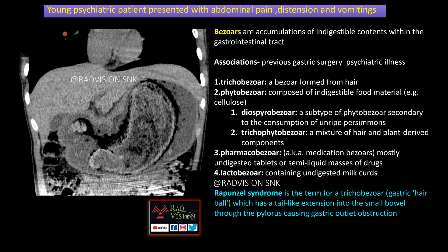Next case: a young psychiatric patient presented with abdominal pain, distension, and vomiting. You can see there is a mixed density lesion noted within the stomach with multiple air foci scattered and trapped within and adjacent to the lesion, along with gastric dilatation. The lesion is also seen partly extending into the pyloric antrum. Whenever you see this typical imaging feature, definitely suspect a bezoar.